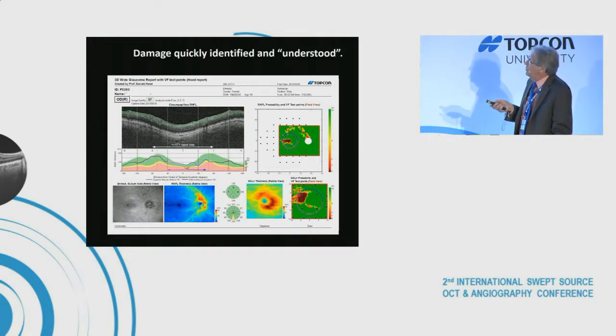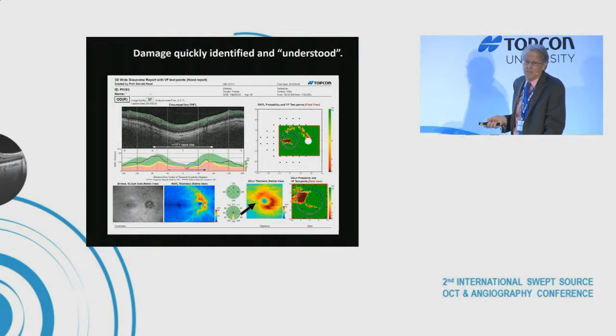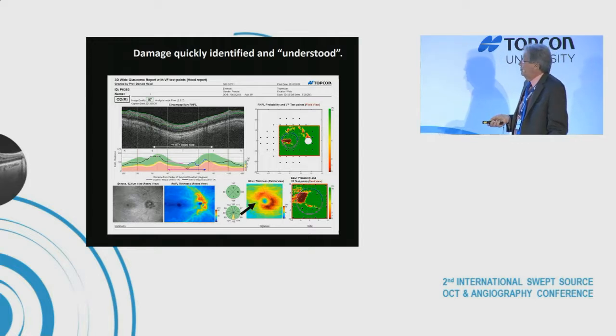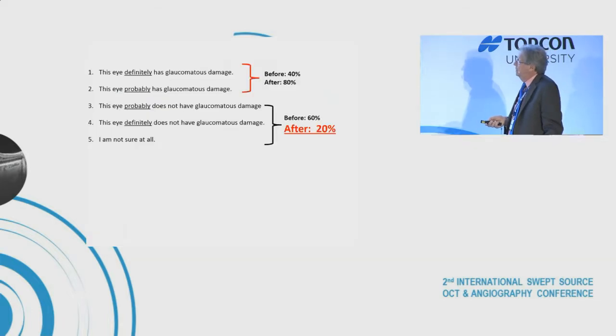So why do I say quickly a glaucoma? Well, the first thing, I know there's a lot of macular damage that's being missed. The first thing I look is here. I mean, that's classic early glaucomatous damage near fixation. There it is on the probability map. It doesn't quite make it into the red here. That's why it didn't show up on the statistics, right? And then there's something going on up here, but that corresponds to this and actually here. So this whole area is actually affected. All right, so why 20%?